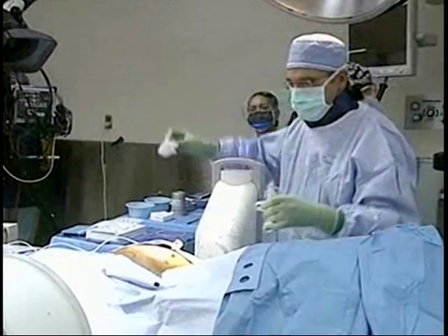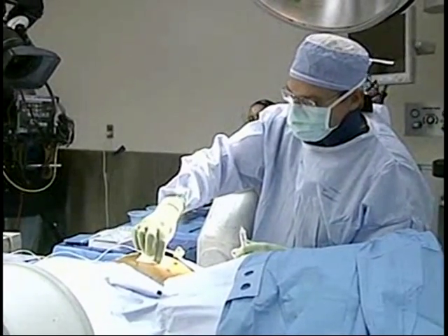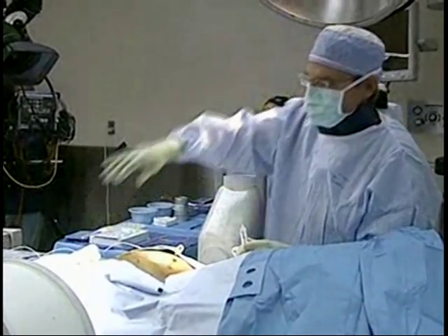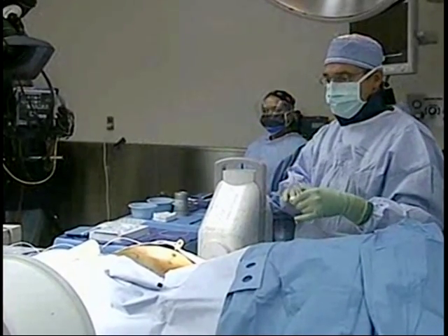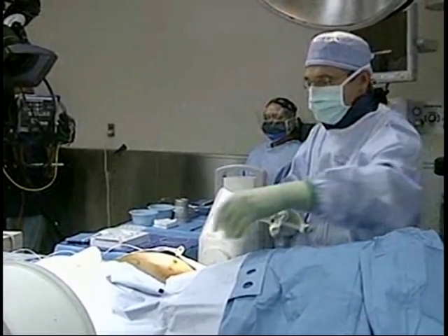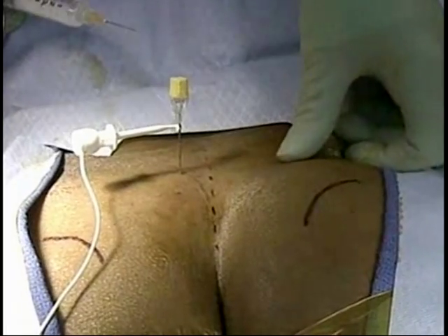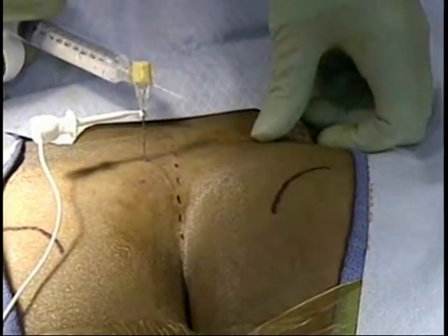I'm going to go ahead and check the contralateral side too. By checking the contralateral side, we can actually go through a test phase and make sure that both are working. Once you find you're in one foramen, usually everything else kind of falls into place.